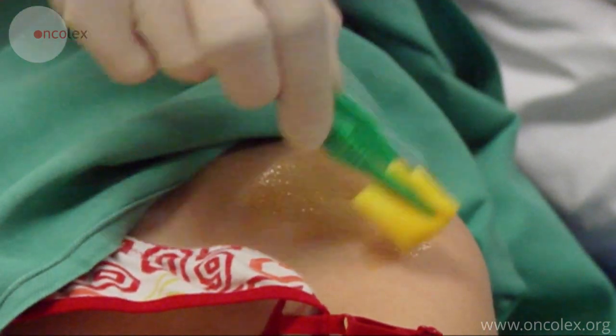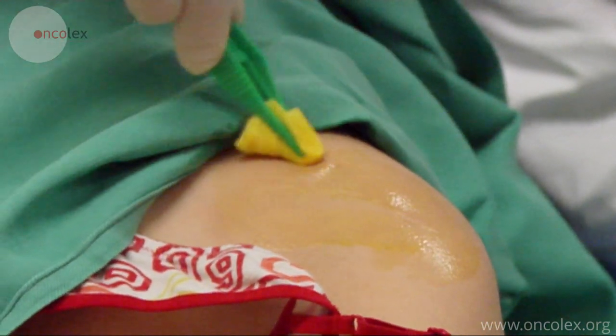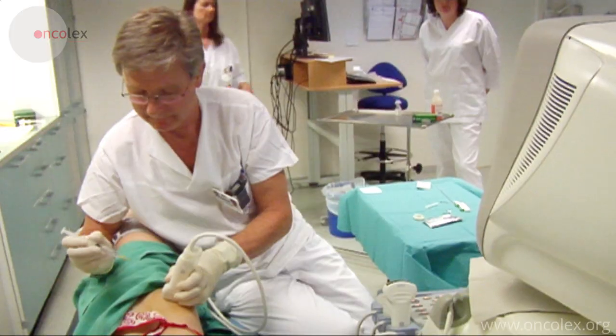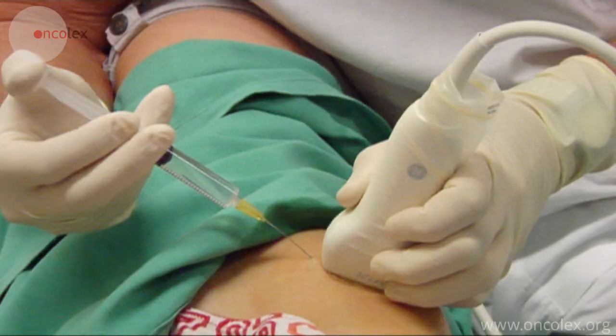The skin is disinfected with chlorhexidine and the procedure is carried out aseptically. Local anesthesia is administered to the biopsy area.